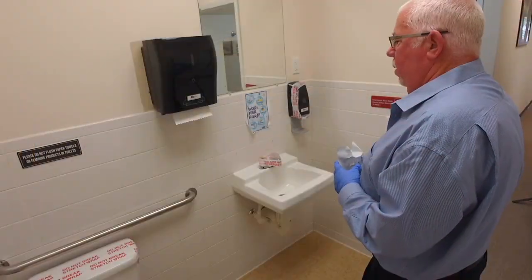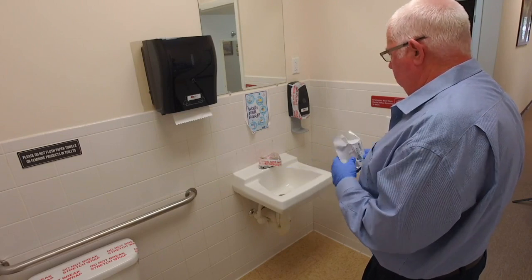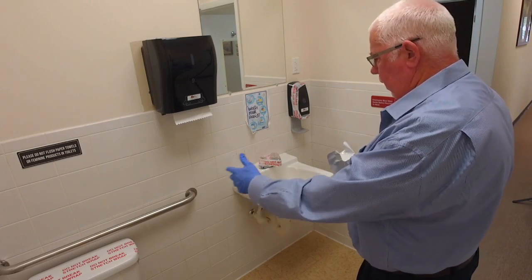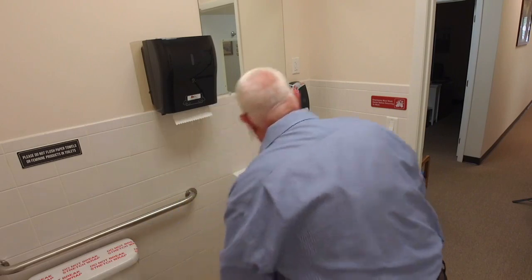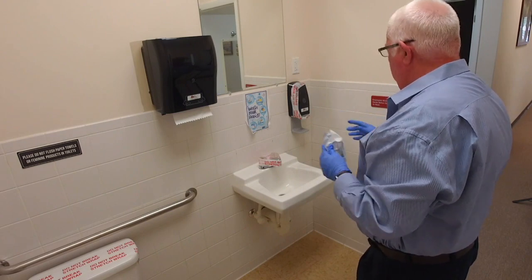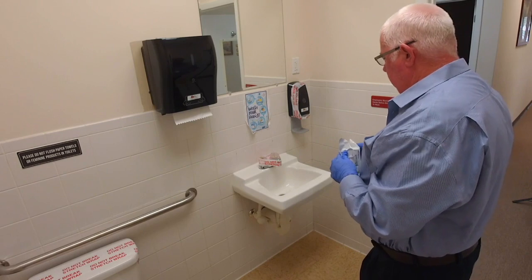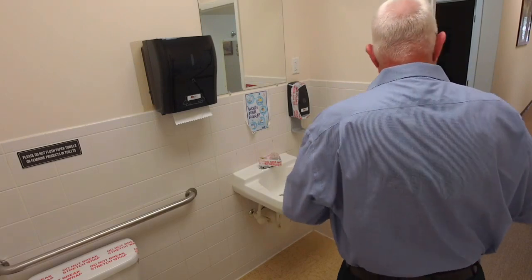Before we do a urine collection, it's important that we secure our restroom. I always check it out before I bring my donor in. I've got my toilet tank secured so that water can't be grabbed from the tank. I have bluing that I put into the toilet. I've got my sink dispenser and running water secured, my soap dispenser secured. We basically want to make sure that there's nothing here that the donor can use to tamper with their specimen. We've removed garbage pails and soap products, and now we have a good secure restroom for a urine collection.